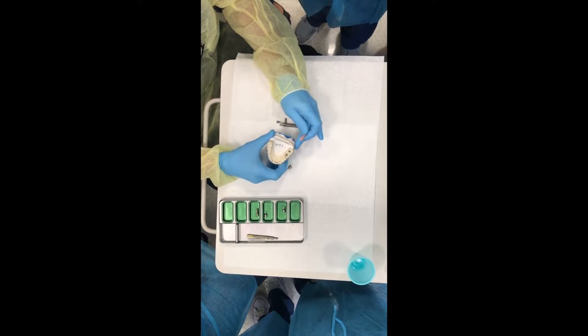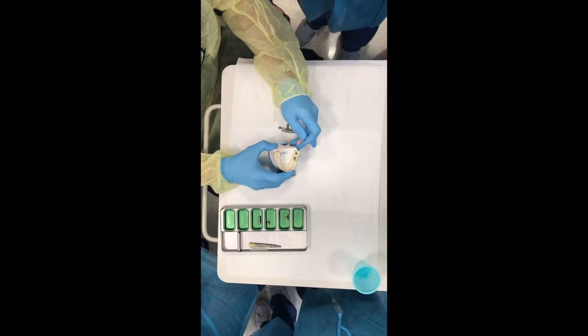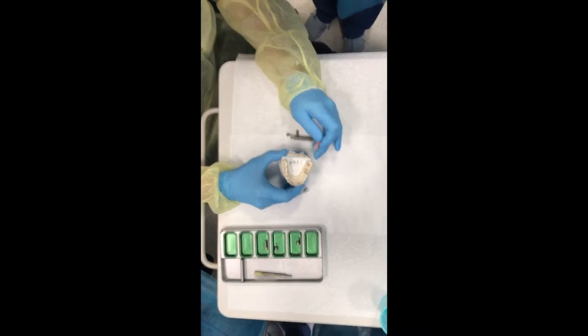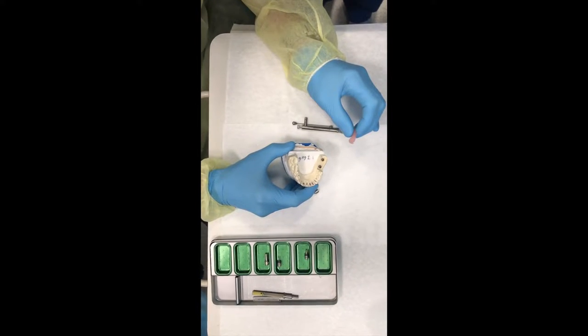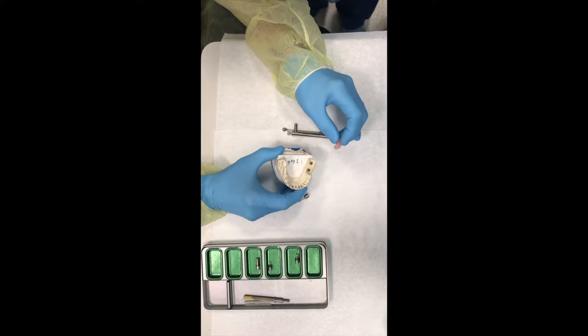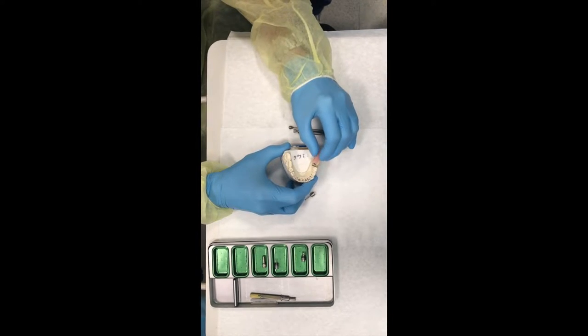You can see the soft tissue on top. You can pull the soft tissue away. You can see what I call the lab fixture analogs, sometimes called the implant replicas. And Straumann has a color-coded system, so you'll see a purple stripe to designate that this would be called an RC implant versus an NC implant.